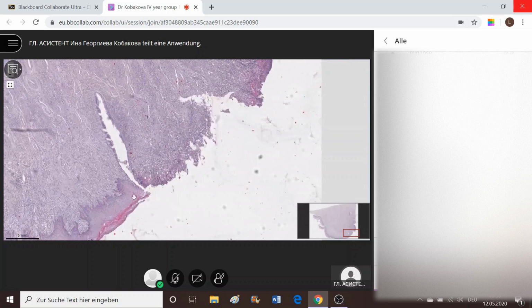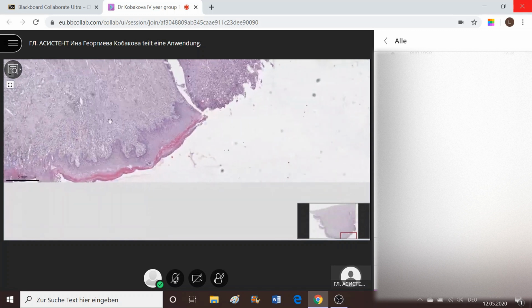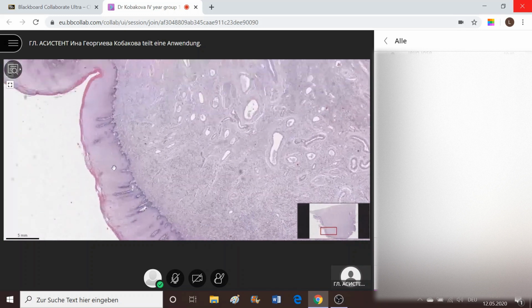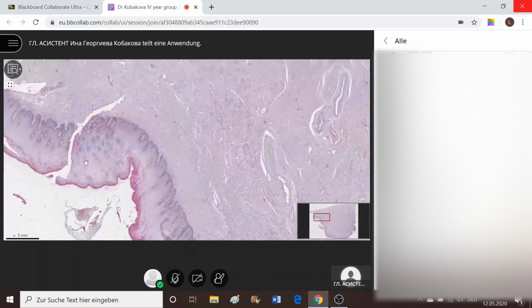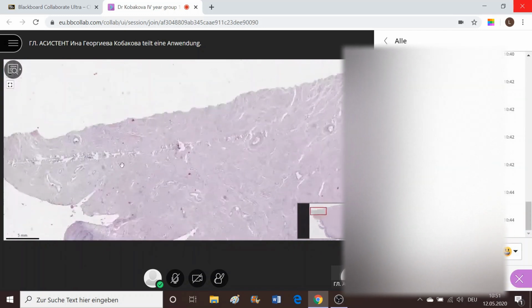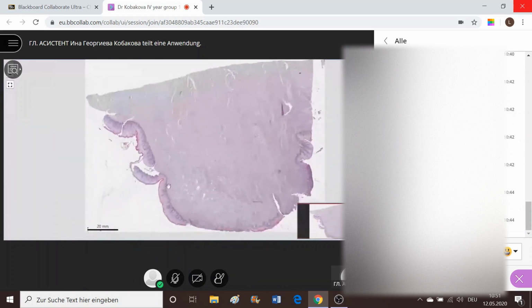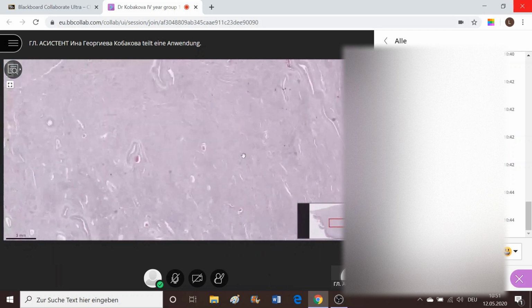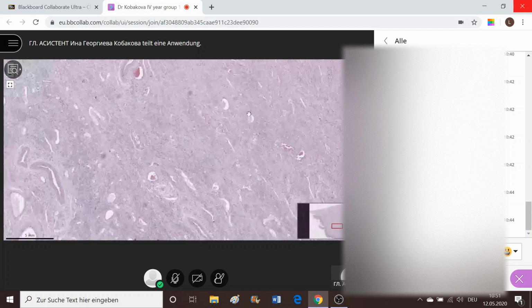Here, a deeper glandular structure. Here, keratinized squamous epithelium again, and missing parts of it further to the slide, along with one which is again covered by keratinizing portions. Now, if I should make a suggestion, it appears to be surrounding something which is rich in stromal elements. So this way of surrounding, we will not consider skin epithelium.